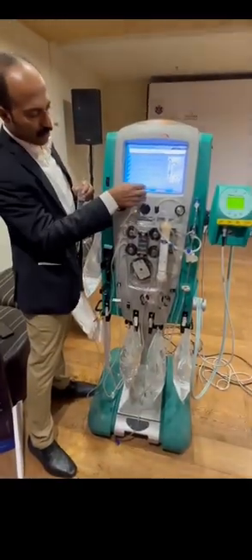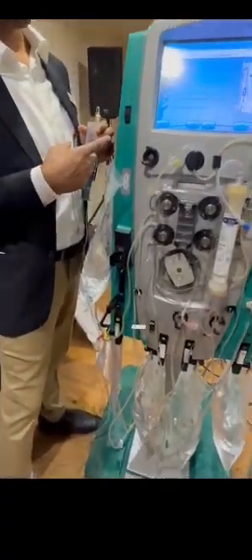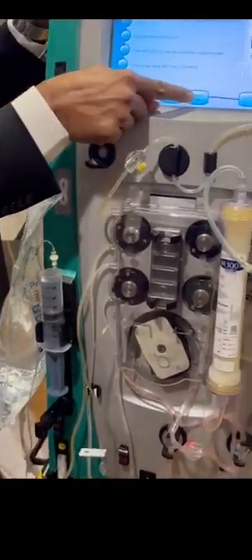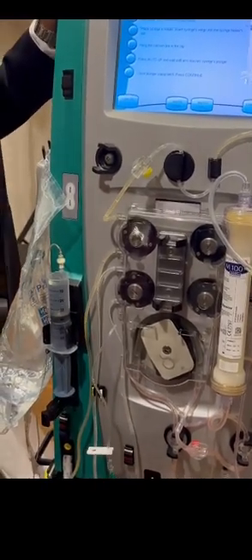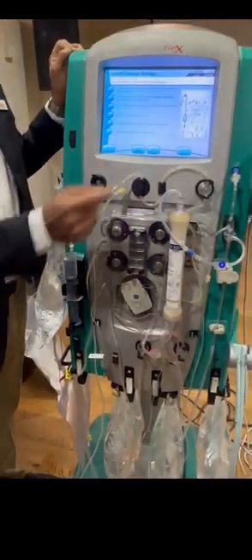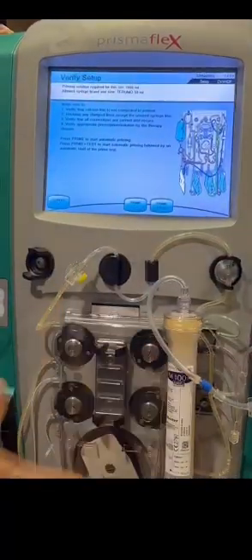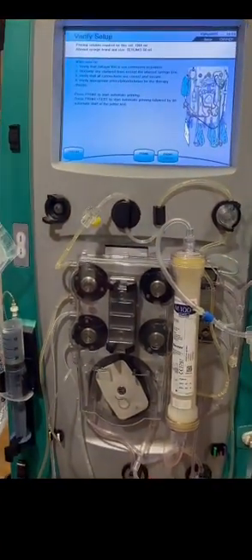To bring the plunger down, we have to press auto down. That option will be available in the next step. Okay, so I connected the syringe, then the auto up option will be there. Then close it, then continue, and confirm. Then we'll go for the prime of the filter. Now we have primed this calcium line. Okay, prime.